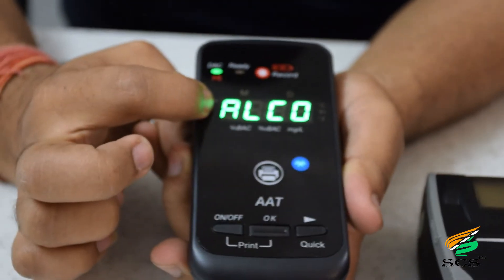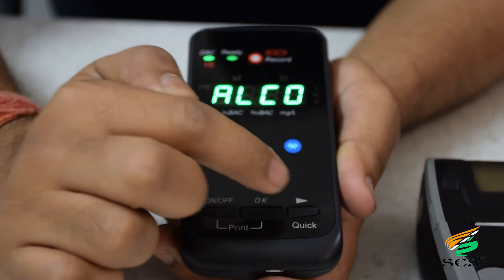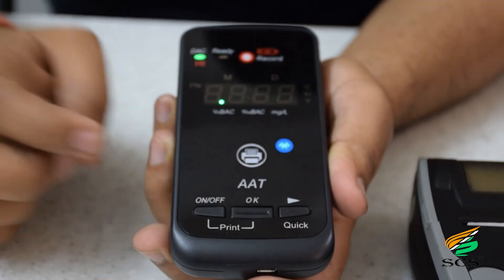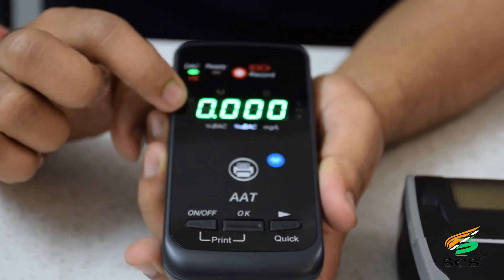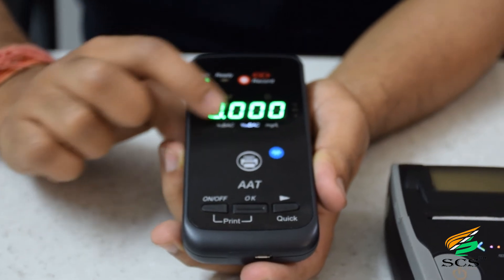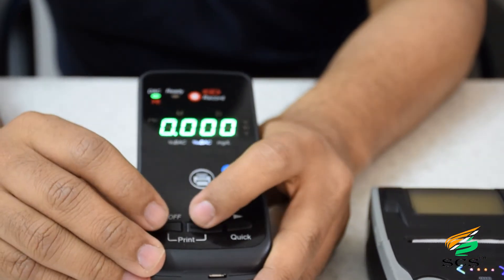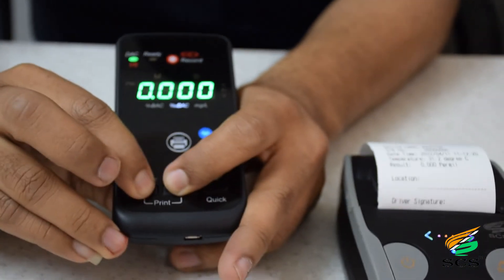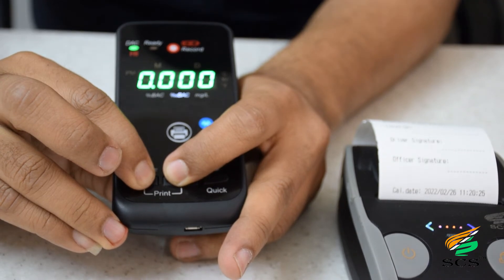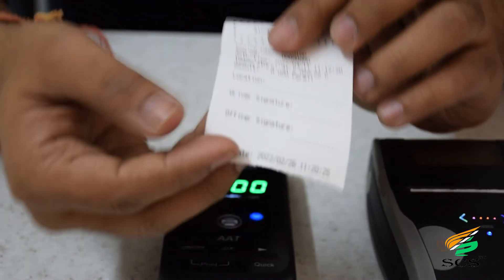For the passive test, click OK — it shows 'alcohol' — then press quick. It shows 0 mg per 100 milliliters, meaning no alcohol found. To print, hold both buttons together and the print will come out from the printer.